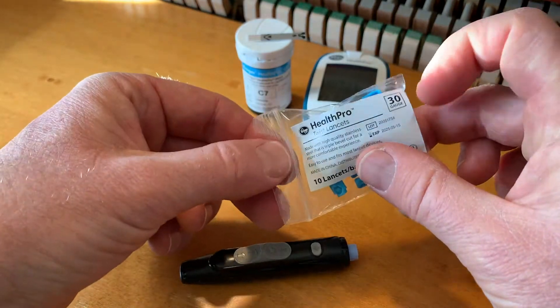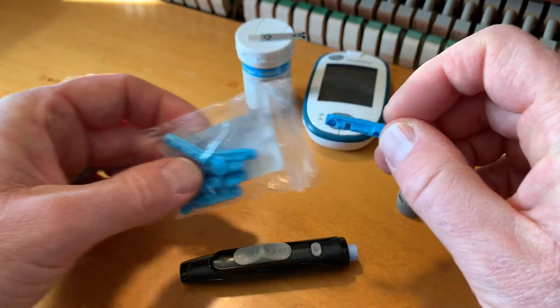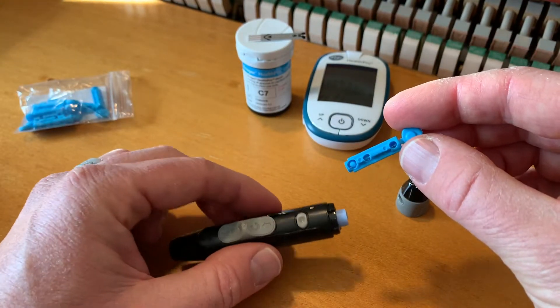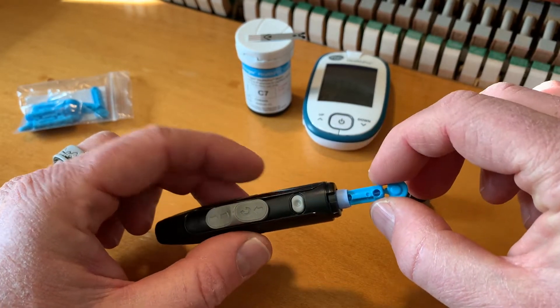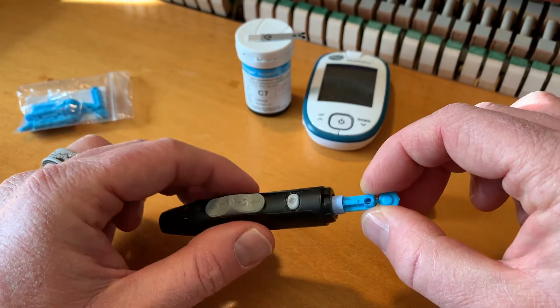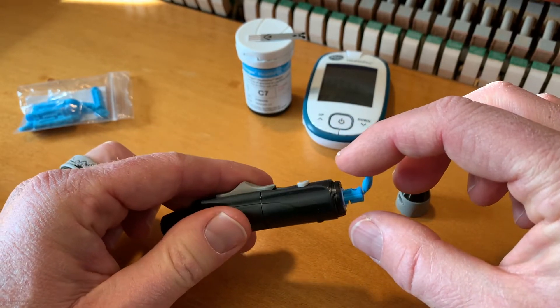We're going to go into our little bag here and pull out one of these blue lancets. Basically what we're going to do — it doesn't really matter which way you put it in — we're just going to push this down into the lancer. And this is going to cock back our little spring loader. As you can hear, it cocked it back there.